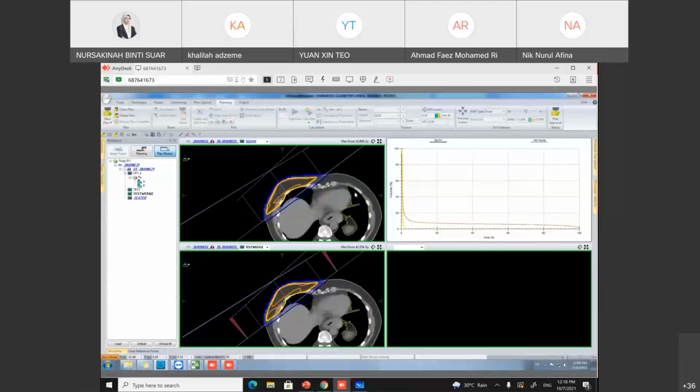So when I came back, we started to play around with this, and we found it very useful. In those days the radiographer needed to put in the physical wedge, and after we applied this, we really saved a lot of time for the whole day and the patient delivery times.